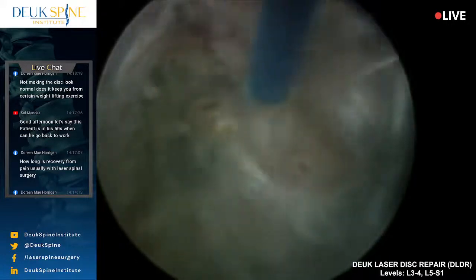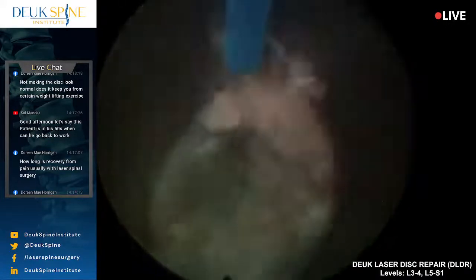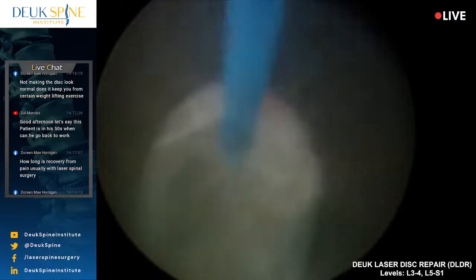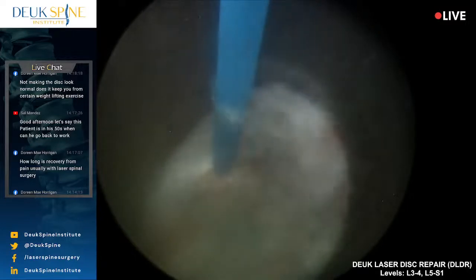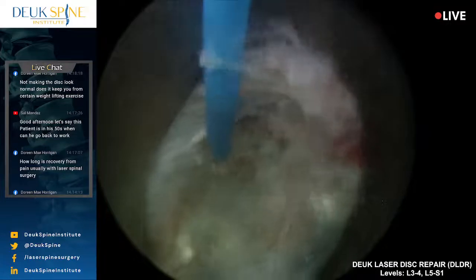Yes, Diego? Yes, doctor. We have a question from Facebook. They say, does this surgery limit you from weightlifting exercises? So the question is, does this laser surgery you're watching limit you from weightlifting exercises? The answer is no. And I'm going to qualify my answer.